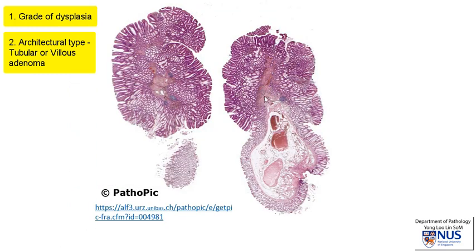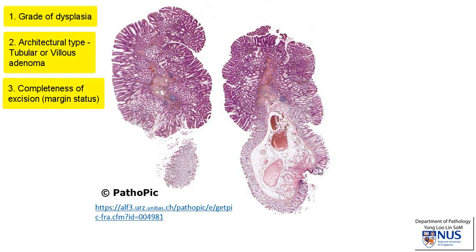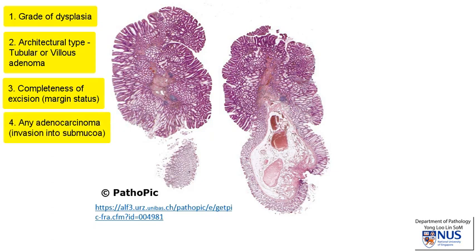The other things we evaluate are the grade of dysplasia — whether it is low-grade or high-grade — and we also try to evaluate whether the entire polyp has been excised, in other words whether there is dysplasia at the excision margins. It is also very important, especially in polyps with high-grade dysplasia, to evaluate whether there is invasive adenocarcinoma — that is, a carcinoma that has invaded through the muscularis mucosa into the submucosa.